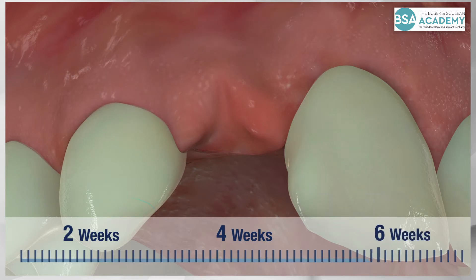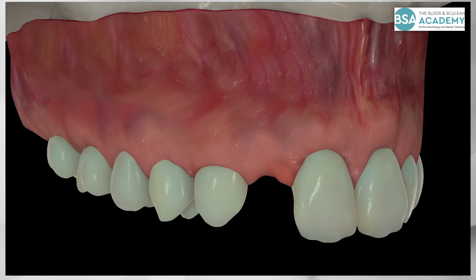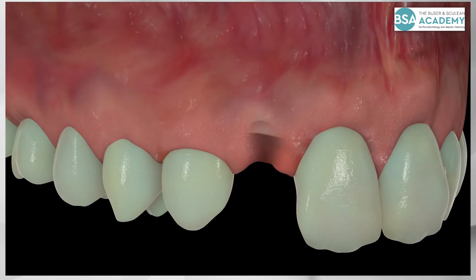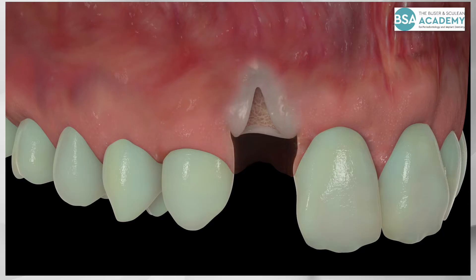However, the ridge contour does not change at the adjacent teeth within a 4–8 week healing period. This frontal view shows the resorption of the thin facial wall triggered by bundle bone resorption, causing a crater-like defect in the middle of the socket.